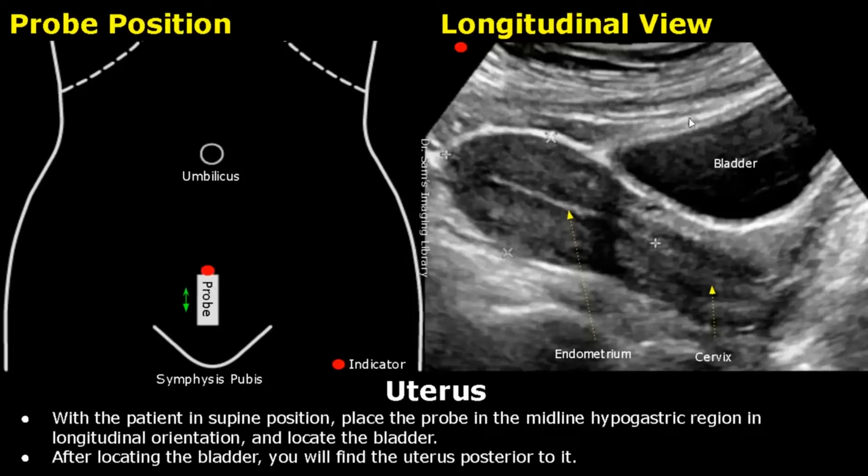The patient's bladder must be full for transabdominal scanning. After locating the bladder, you will find the uterus posterior to it. Here is the endometrium and this is the cervix.